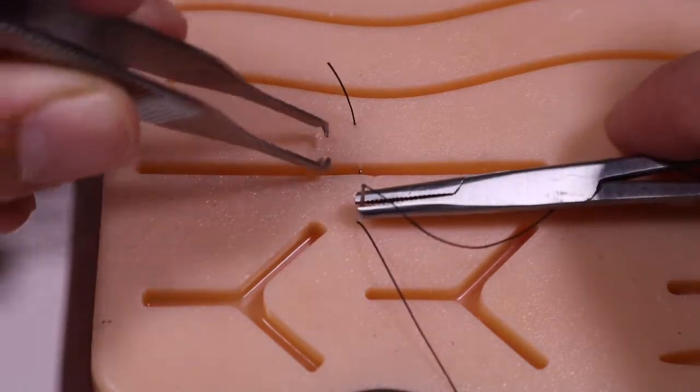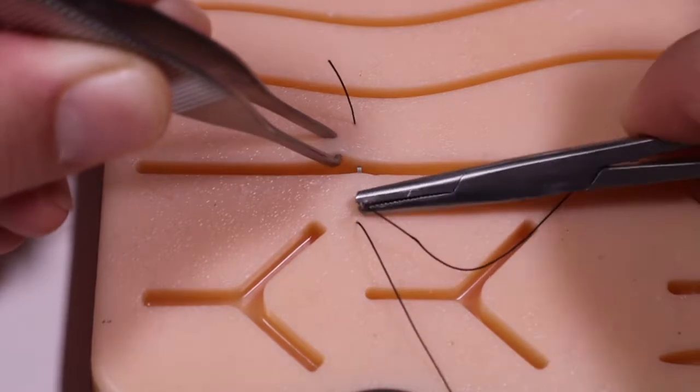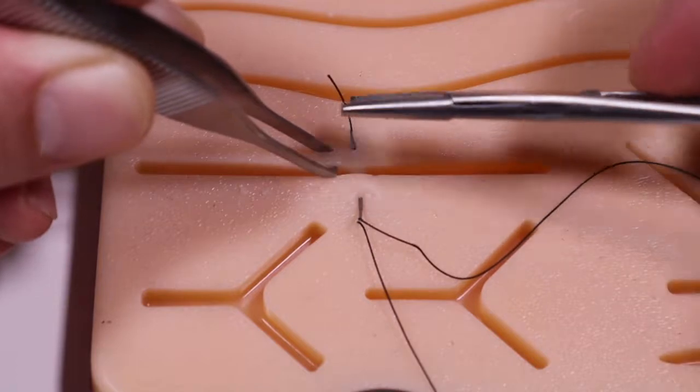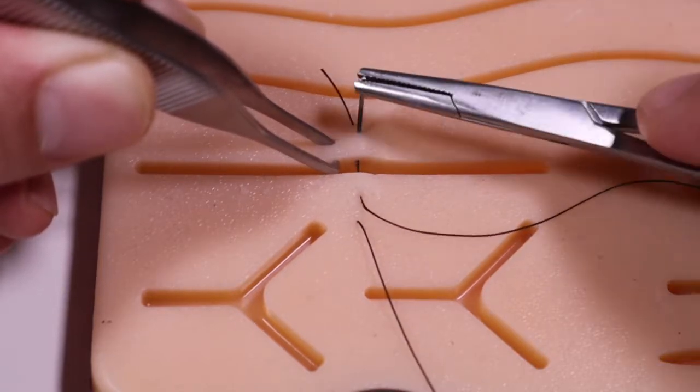Just a few millimeters from our wound edge. If you want to pass this one all the way through it's easier, but it's certainly acceptable to come out of the wound edge and then pass the far side as well.